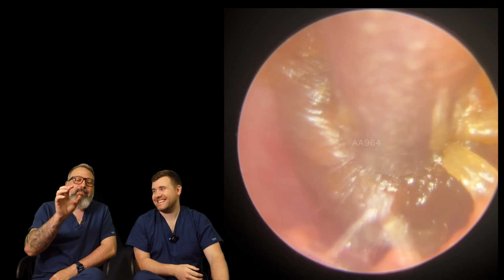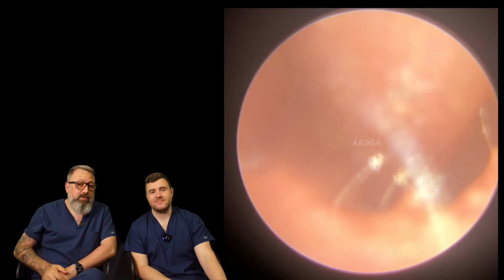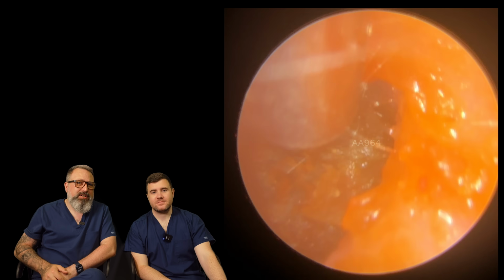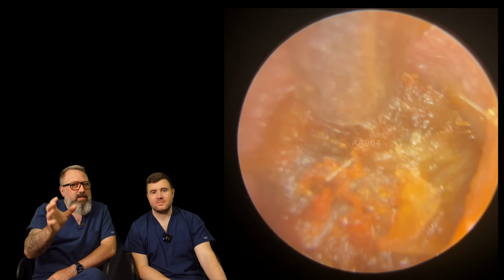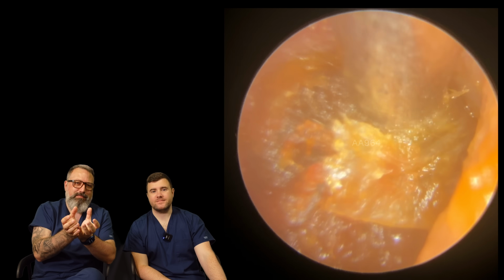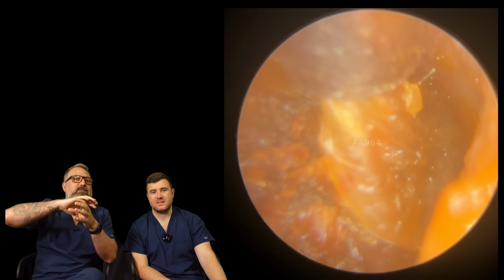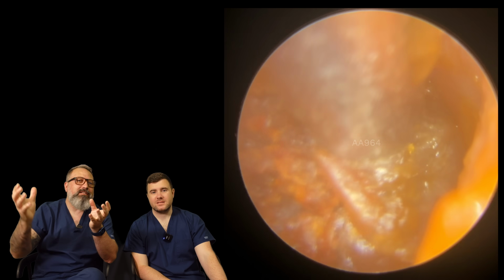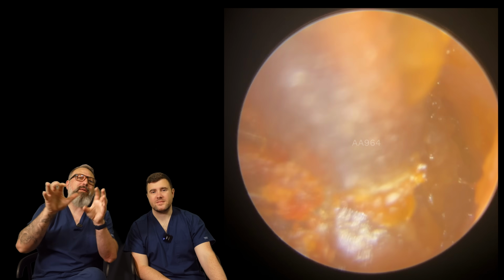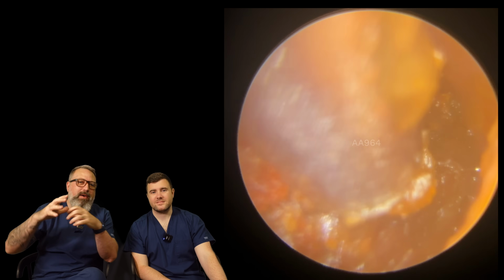But you can see by putting the oil in, it just takes some of the stickiness out of this wax as well. Yeah. We're just going to start to try and lift around the edges. It's always a little bit difficult with these types because it is fully formed, perfectly formed to the shape of the ear canal. So it doesn't want to come away easily. It's got this sort of very thin epithelial layer from the surface layer of the canal wall skin that's come away and kind of wrapped around it as well. So it's like this sort of wax parcel with this skin wrapping.